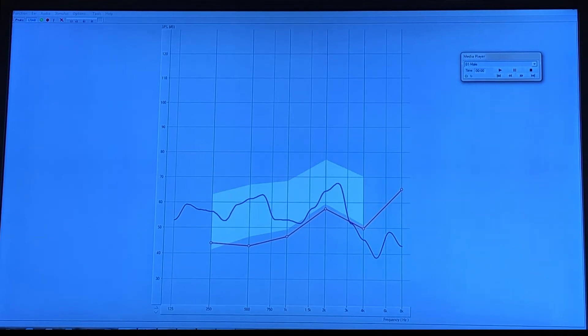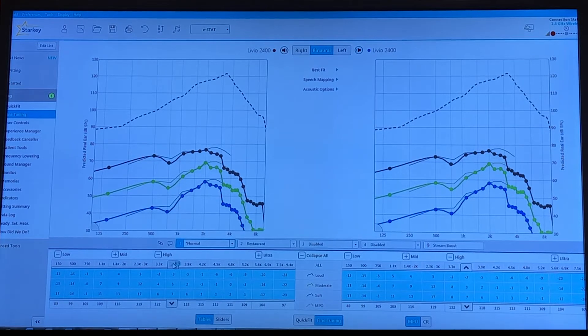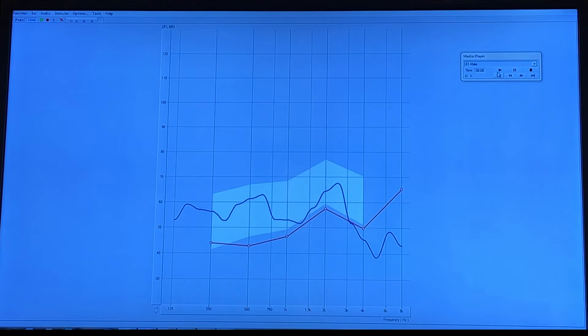We'll probably make some improvements to increase the middle section. The blue line is what we're looking at — we want that line to fall within the white shaded range that you see on the screen. So we're going to make some little adjustments, based on the audiogram itself and also on your subjective opinion of how things sound. We're going to go ahead and rerun this again.